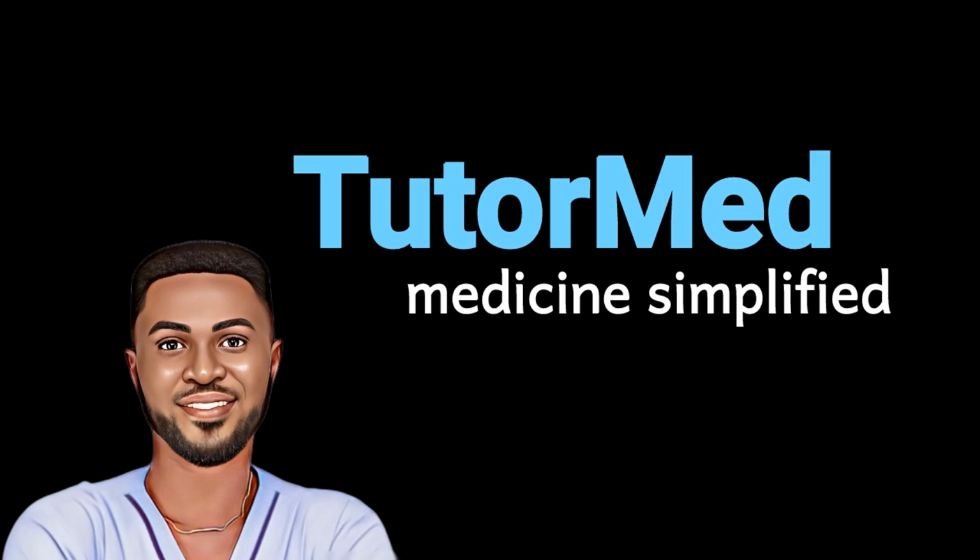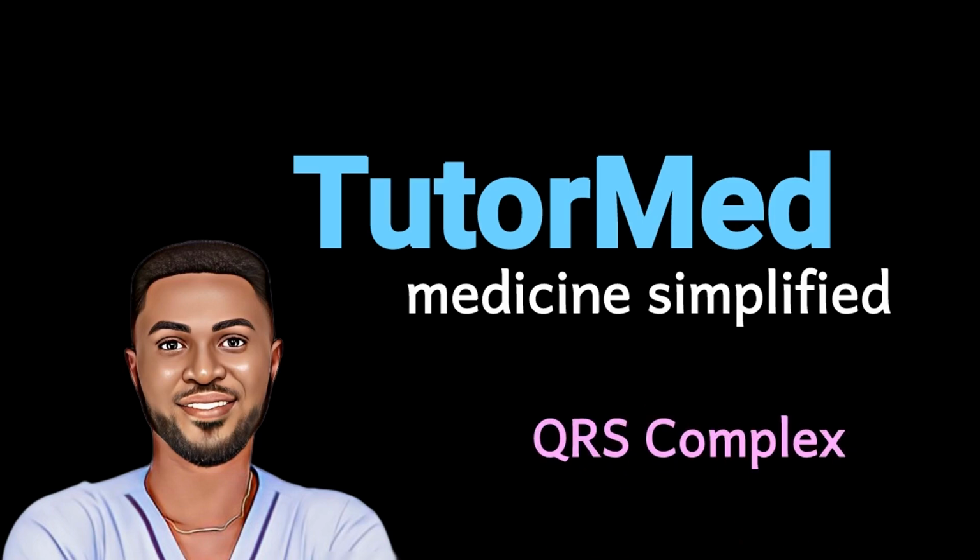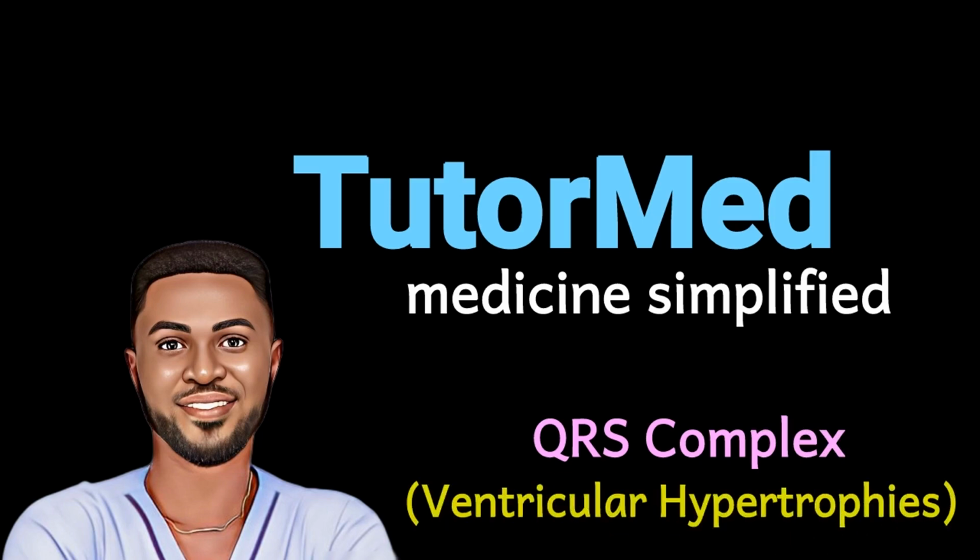In the previous video, we got a basic understanding of the QRS complex. Now, we want to discuss the pathologies the QRS complex can show, and in this episode, we will discuss ventricular hypertrophies. Alright, so grab your notepads and let's get started.